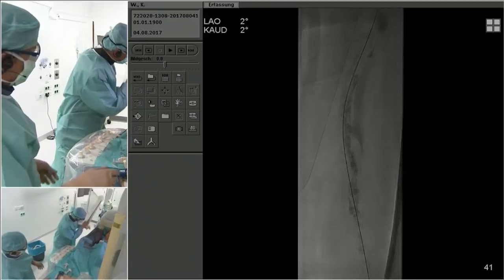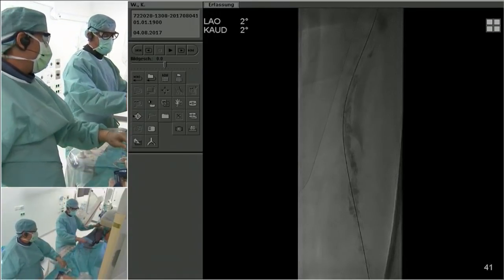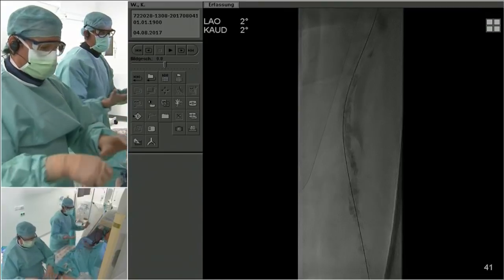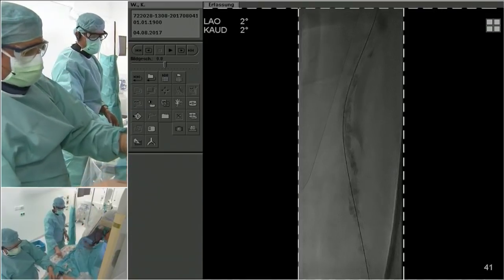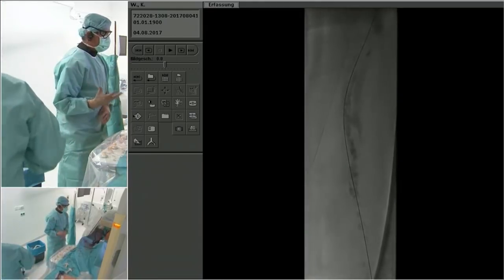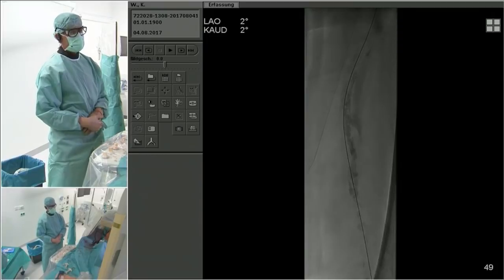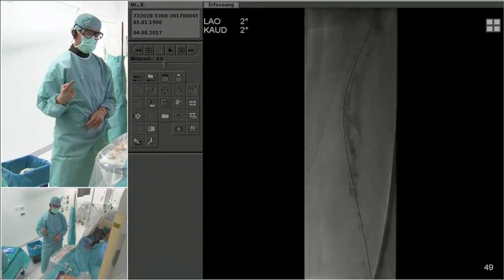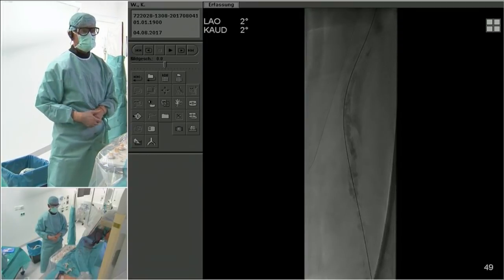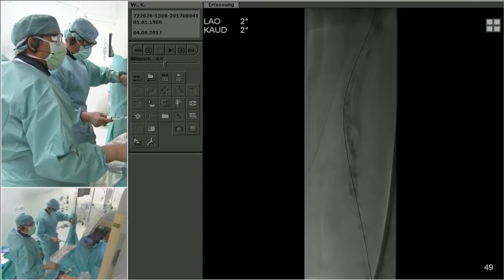So if we implant a 7 millimeter Viabond, we take the 6.5 outer diameter Supera in, which fits very nicely. Then it's really no problem to take it in. However, the Viabond really has to be absolutely nicely open, and a 6 Viabond is a 5.5 Supera. Whether a 7 millimeter outer diameter Supera fits into a Viabond, I cannot say. You have to tell us.